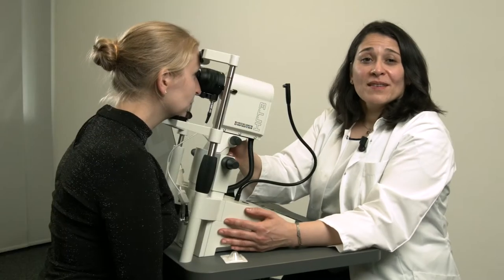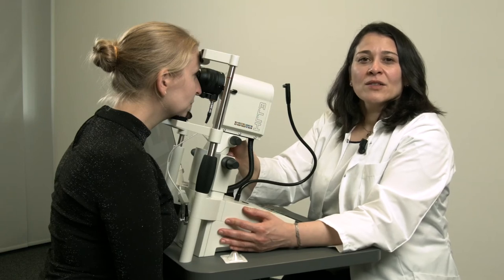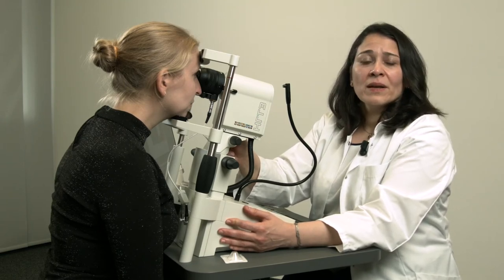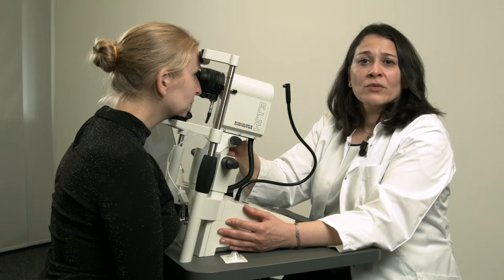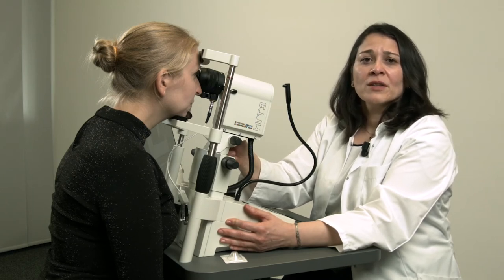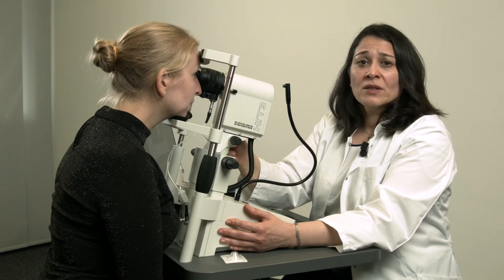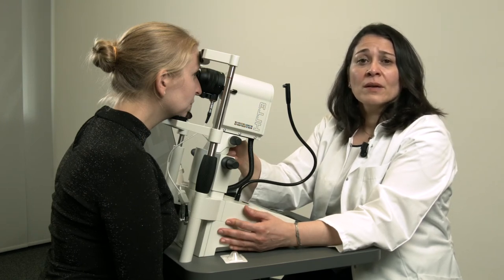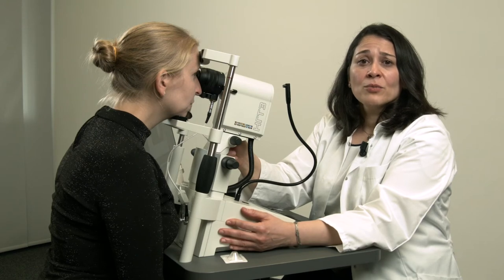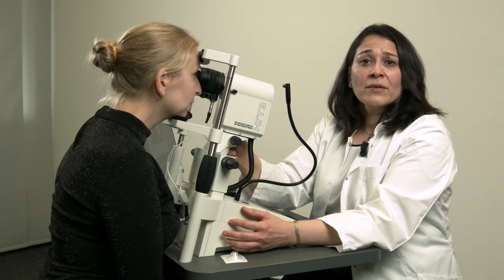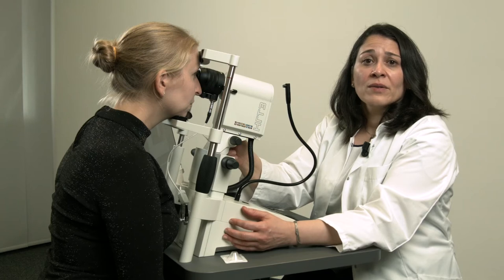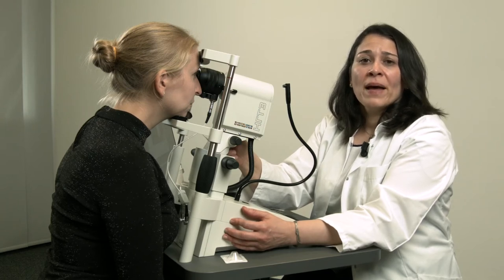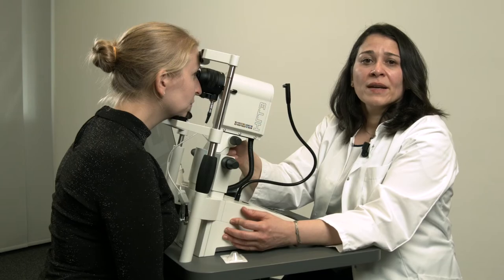Another tip is if thin layers such as sub-basal nerve fibers, plexus or endothelium are not displayed as a whole image but only in stripes, then the contact surface of the cornea is not perpendicular to the laser beam. For horizontal stripes, it usually helps to adjust the height of the camera, and for vertical stripes to move the camera laterally. If in doubt, look directly at the patient's eye to select the correct direction of movement or move back a little and approach the cornea again.